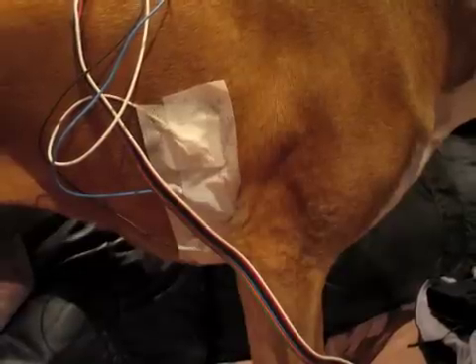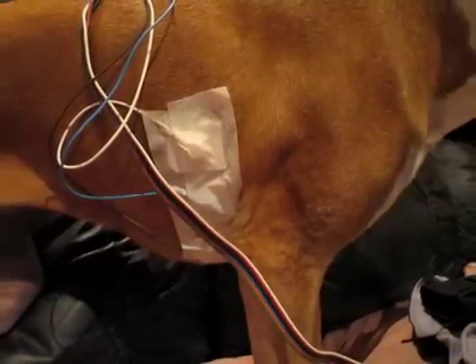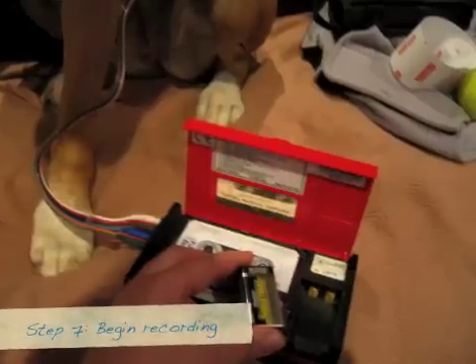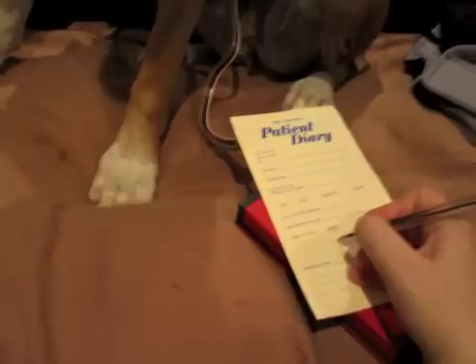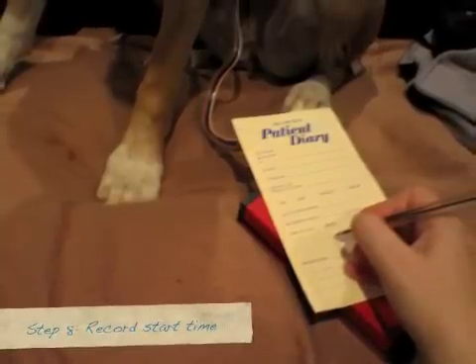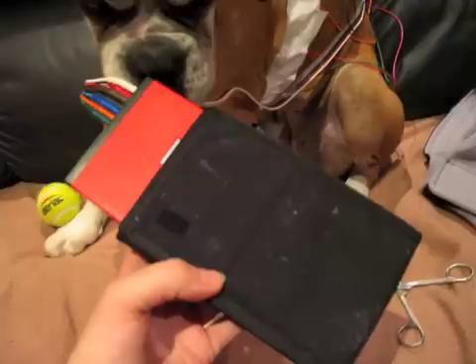So that's what you hope it will look like at this point — the electrodes are now firmly stuck down. Now all ready to start the actual recording because the electrodes are attached and secure. For my machine, at this point I put the battery in so that the recording has started. I then need to record the time that I start and I just note that on the patient diary.